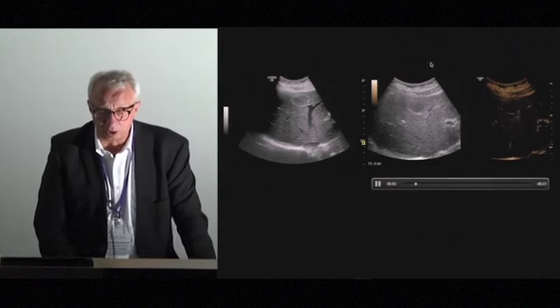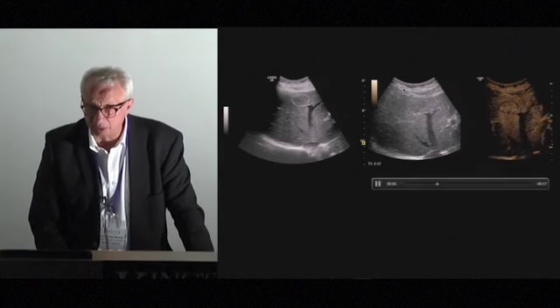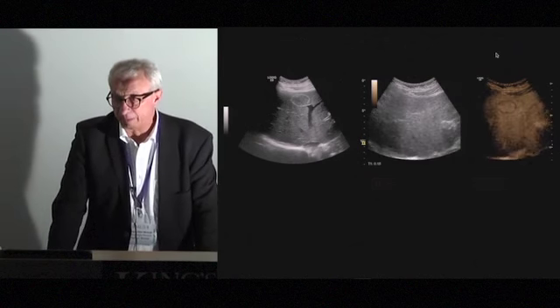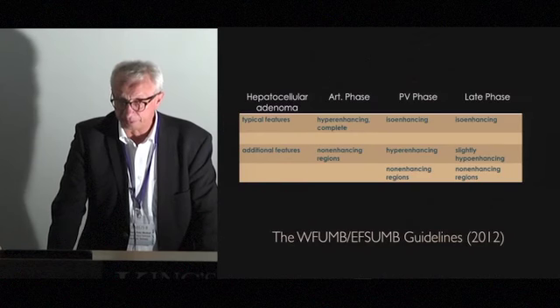This is another one. Also, you can see on grayscale already that there is an encapsulated lesion, and you can see it much better on contrast. So there is another hepatocellular adenoma. These are the guidelines.